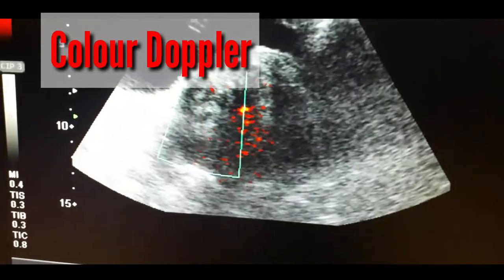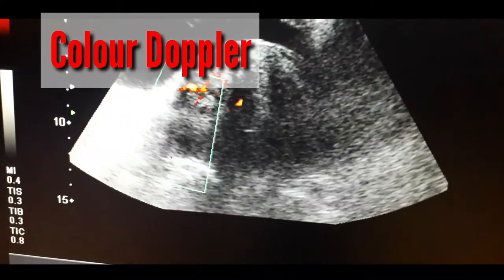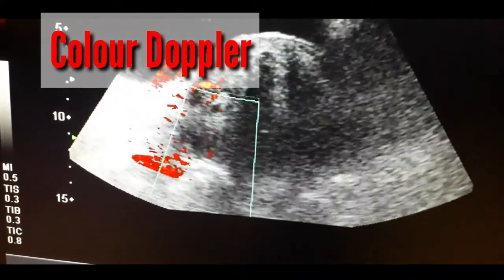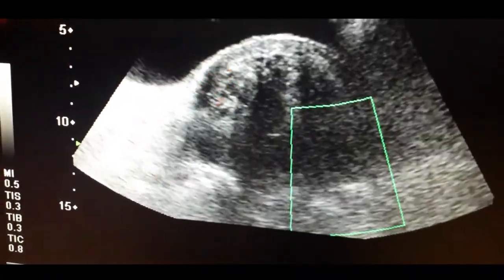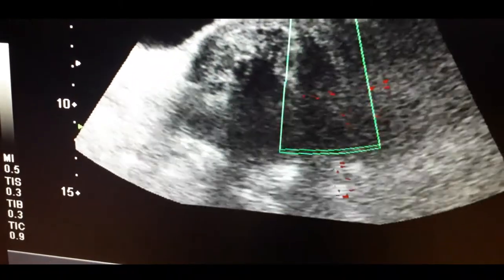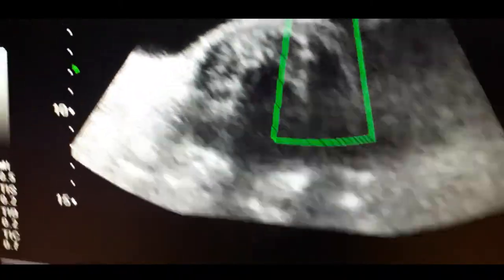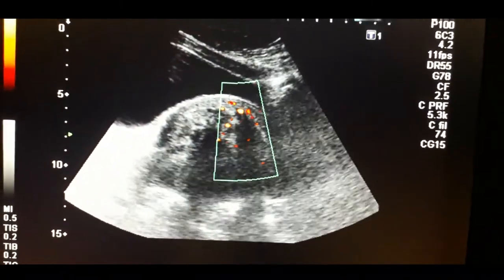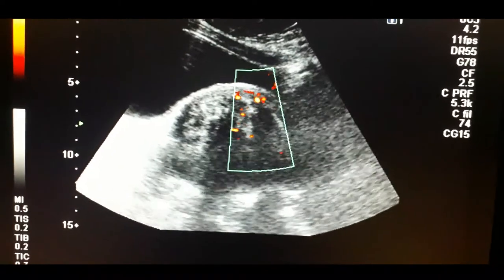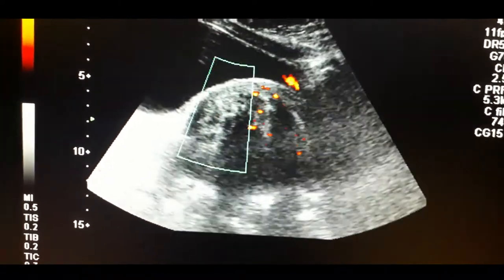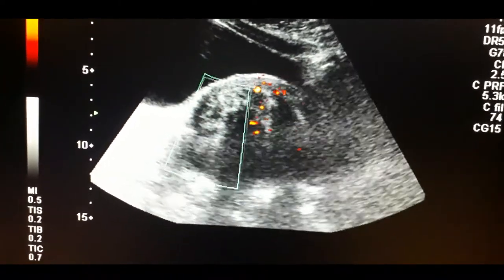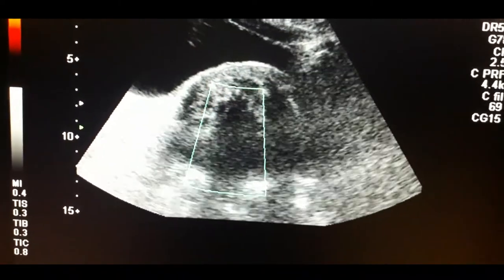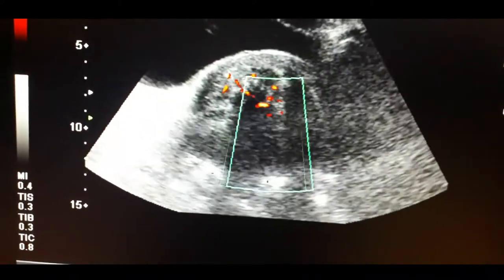Now I would like to apply power Doppler to assess the vascularity within the mass. You can appreciate the blood flow within the mass, confirming that it has vascularity.